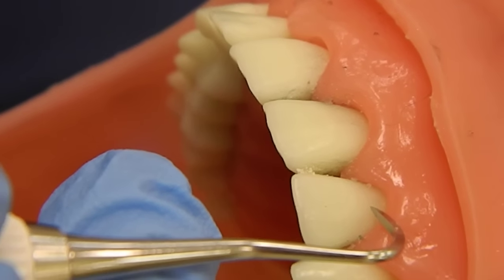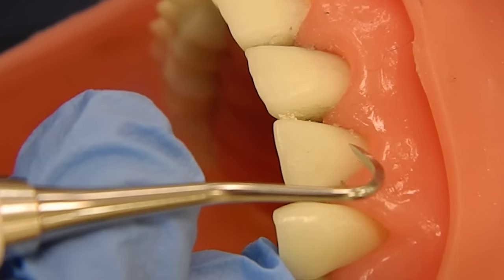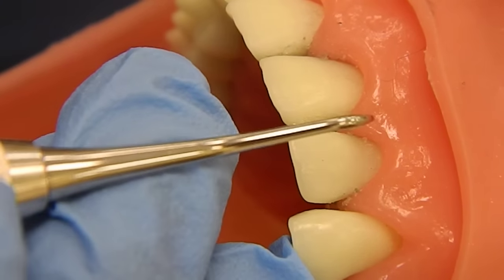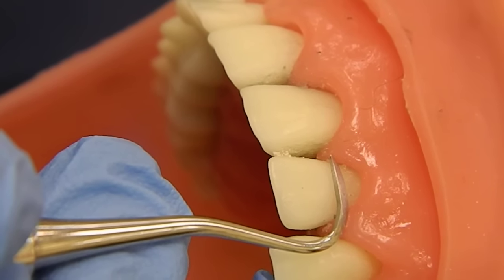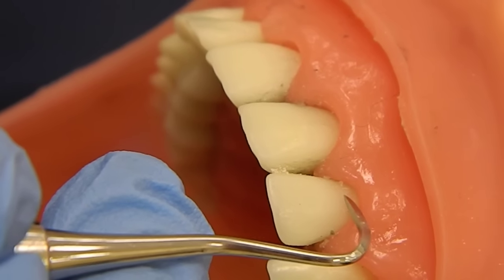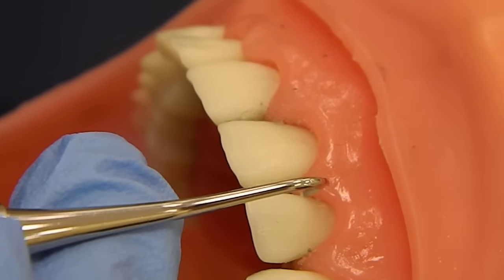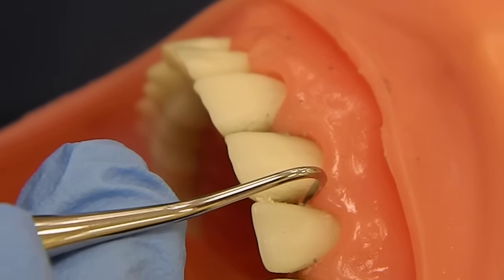Start a little bit before the midline to overlap and activate the stroke. Because this instrument has such a big bend in it, you have to turn the instrument very fast. Don't keep it too flat — you don't want to be down like this or you're going to poke the gums, and you don't want to be on the tip. Just on the very side of the tip. You've got to turn with every stroke, just like with the explorer — turn the tip inward toward the tooth, and hug that tooth.